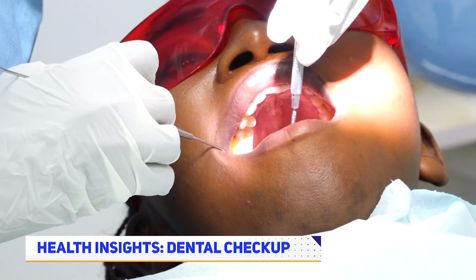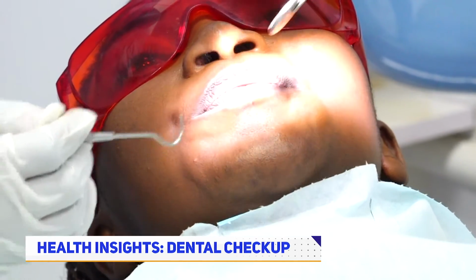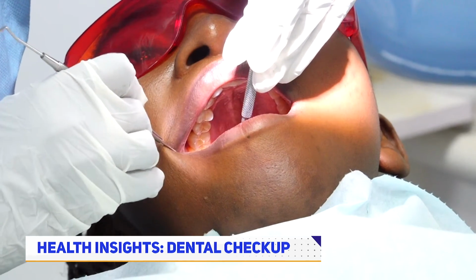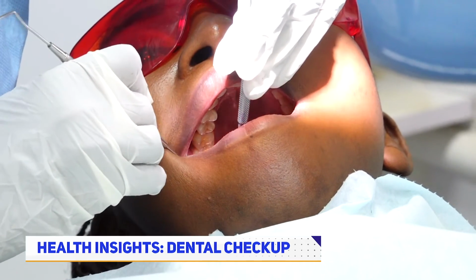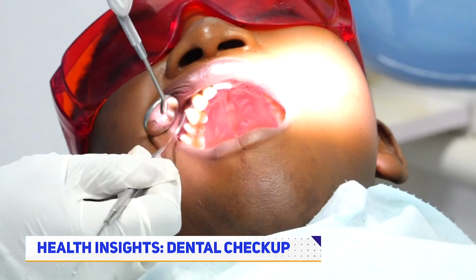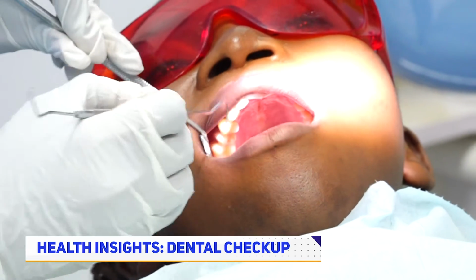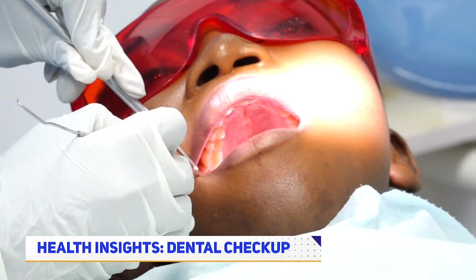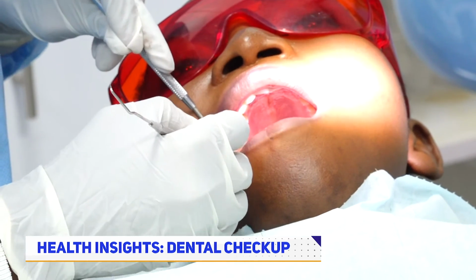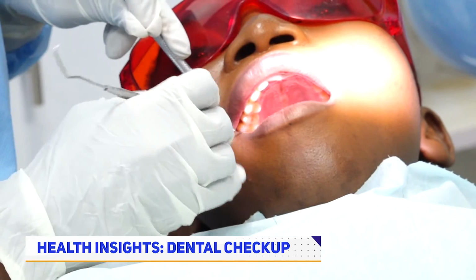So I might touch a tooth like this, press it in, and ask the patient, is there any pain? No. So that tells me that tooth is not having any issue. But if a patient reports that they are feeling pain, we mark it in our mind and remember to note that that tooth was having a feeling of pain. If I press around the gum and some pus comes out, then we're able to tell that tooth is having an infection. Then we also check the condition of any concerns that the patient has. This patient has a concern at the back tooth, so we look at it to see if it's broken or if anything is wrong with it.